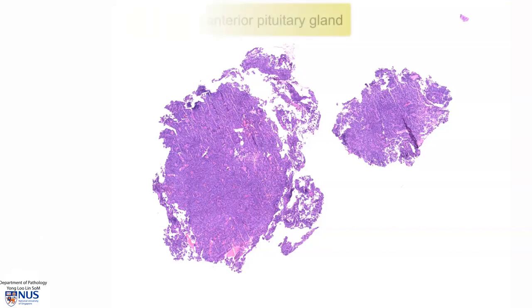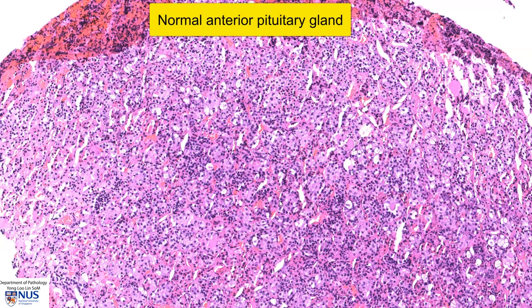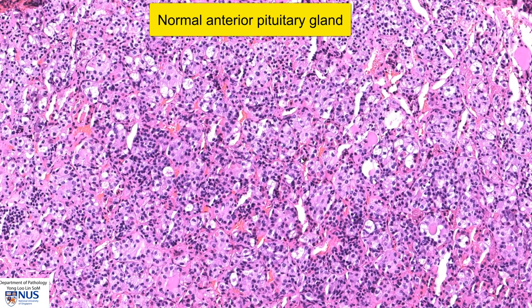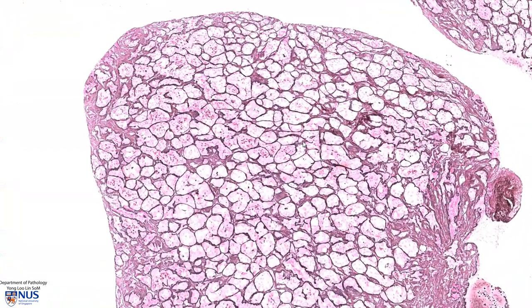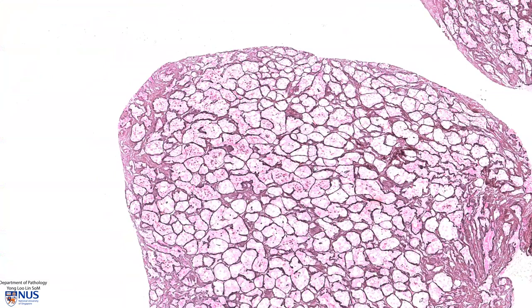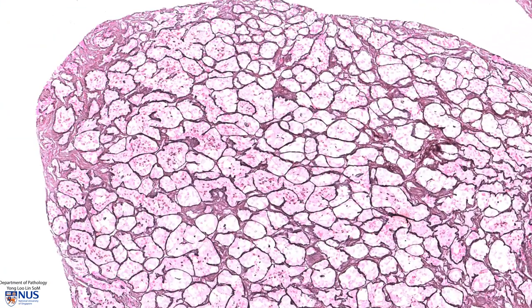This is a normal pituitary gland showing the anterior pituitary. We can see a sort of nested architectural pattern, again with a very prominent but delicate vascular network. This is the typical appearance of a reticulin stain. Reticulin is a type of connective tissue, and we can see this very beautiful, clear-cut nested appearance of reticulin fibers going around the nests of normal cells in the anterior pituitary gland.